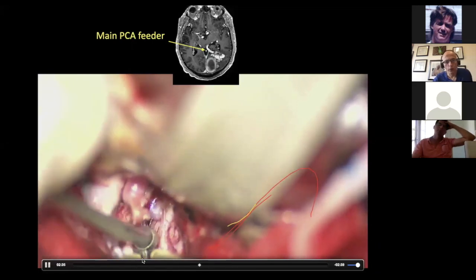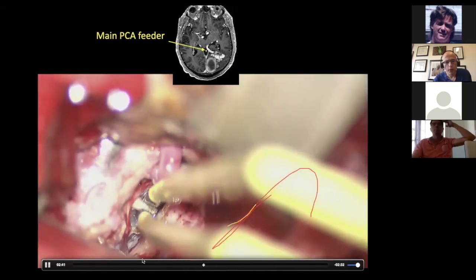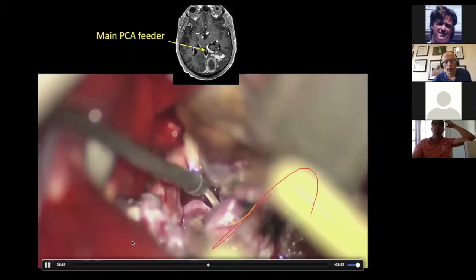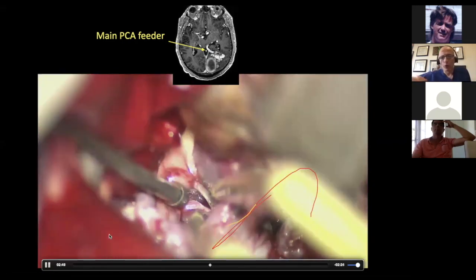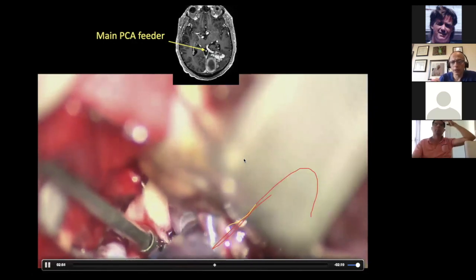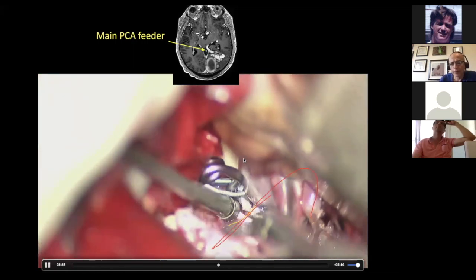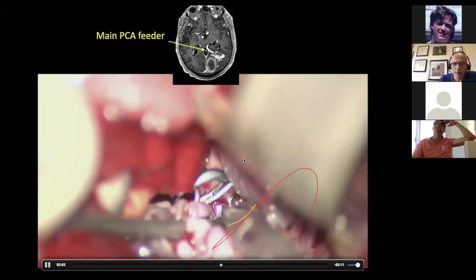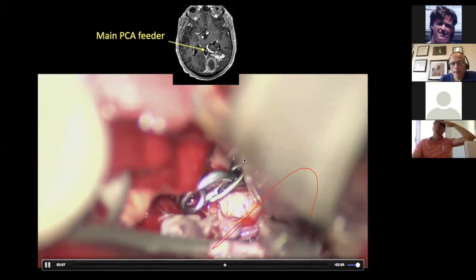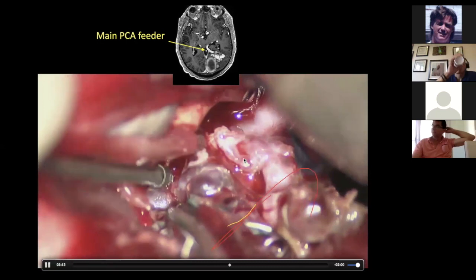So there's a longer version of this video you can watch. It's published. All the feeders one by one. At your right hand, dominant hand, working under this varix and the retraction gets tired over time. So if you feel like you're getting tired, just rest. A few minutes, you know, relax and stretch and then come back. Don't take a risk.